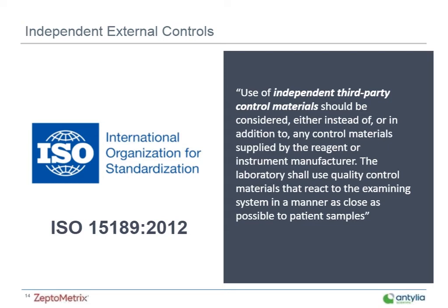A rigorous QC program in your lab not only helps to fulfill these regulatory requirements that are set forth by ISO and CLIA, but also it increases your result confidence, right? So it can also enhance your efficiency in the laboratory, and it saves you money. It minimizes the waste. And by and large, the goal of it is to simplify your laboratory procedures. You want to take the guesswork out of what you're doing. So all of these regulatory bodies, ISO, CLIA, CLSI, CAP, really they're looking to make quality control a standardized procedure.